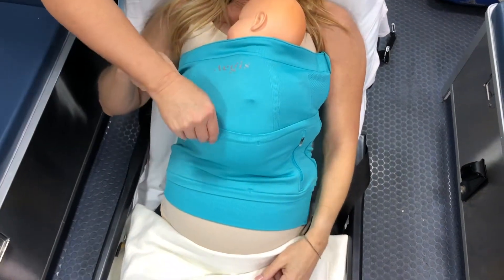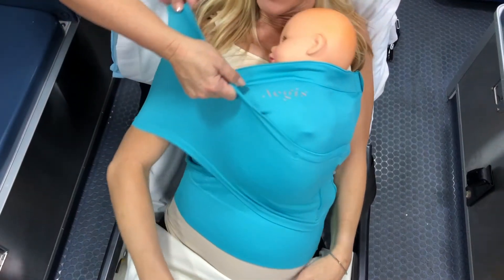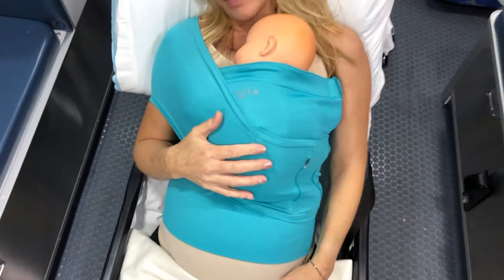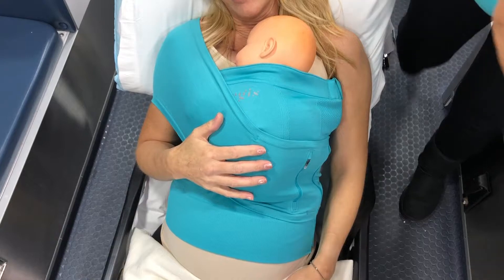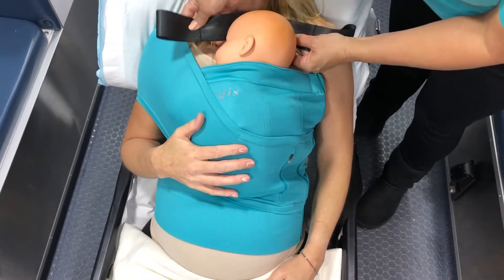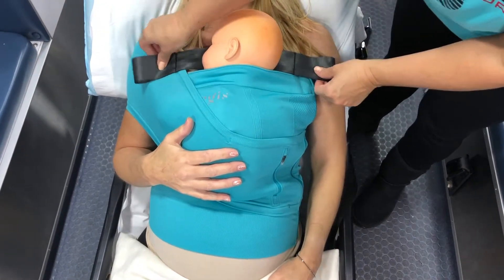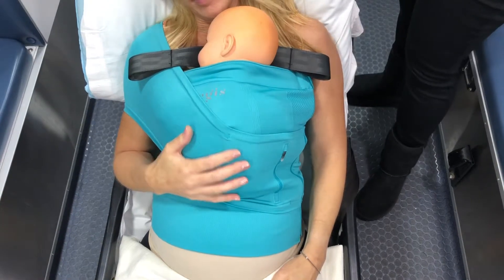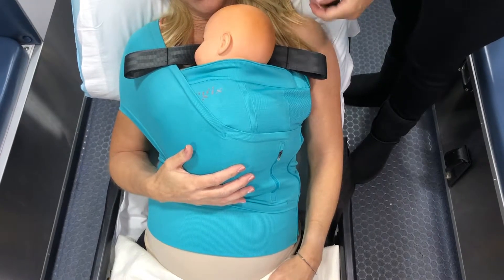Mother should place her right arm into the shoulder sling strap around her torso. Pull the shoulder sling strap up onto mother's shoulder. Place the abio strap across mother's chest under her collarbone. Pull the ambulance cot shoulder restraint straps through the abio loops and secure on each side of mother's torso, forming an H harness.